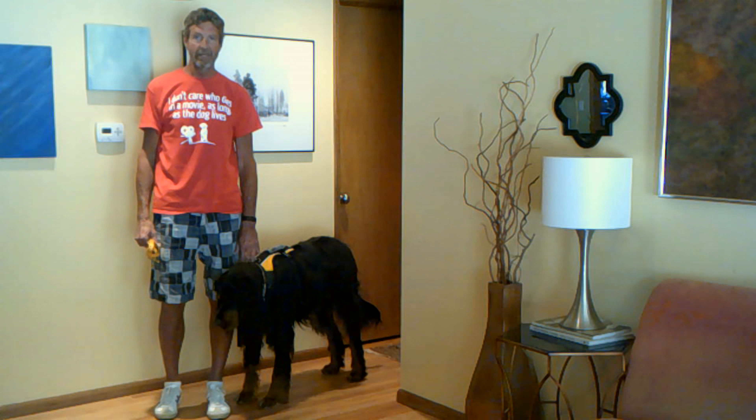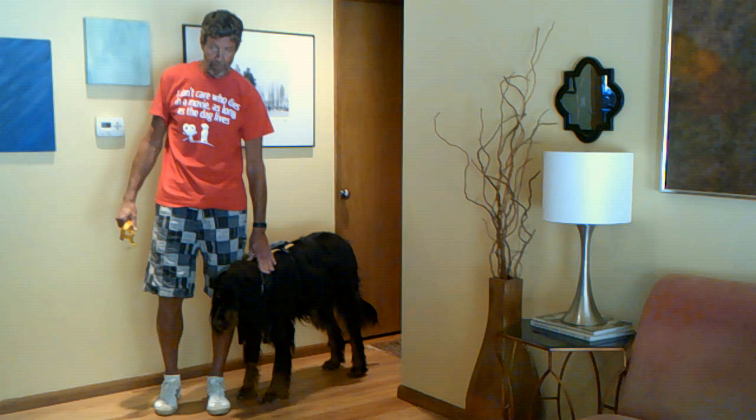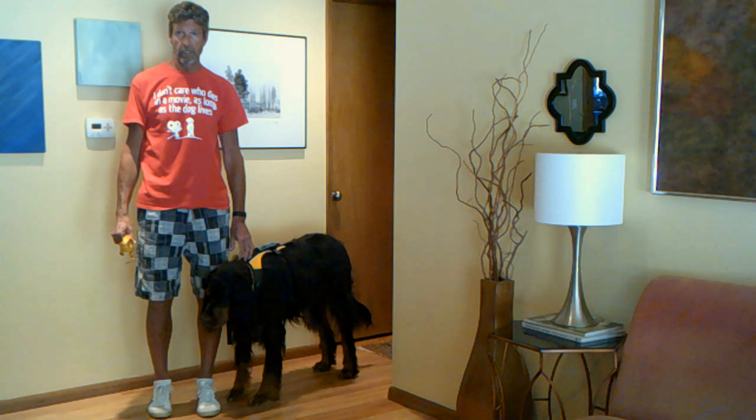Hi, my name is Jeff and I'm the owner of Canine Mobility and the inventor of the anti-knuckling device. This is my friend Brody and today we're going to demonstrate how to measure your dog for the anti-knuckling device.